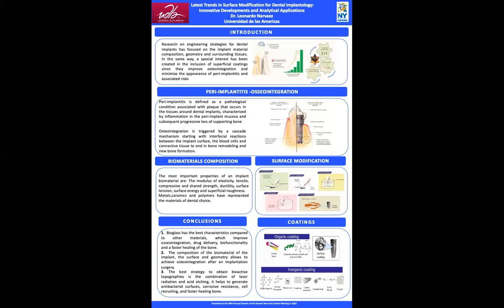The strategies to obtain bioactive topographies with surface modification in the implants are sandblasting, laser radiation, acid etching, anodizing, and plasma spray. Referring to the coatings of implants, the biocompatibility, osseointegration, and therapeutic antibacterial effect have been considered as one of the most important factors for the long duration of implants. These novel coatings have been divided into two groups, organic and inorganic.